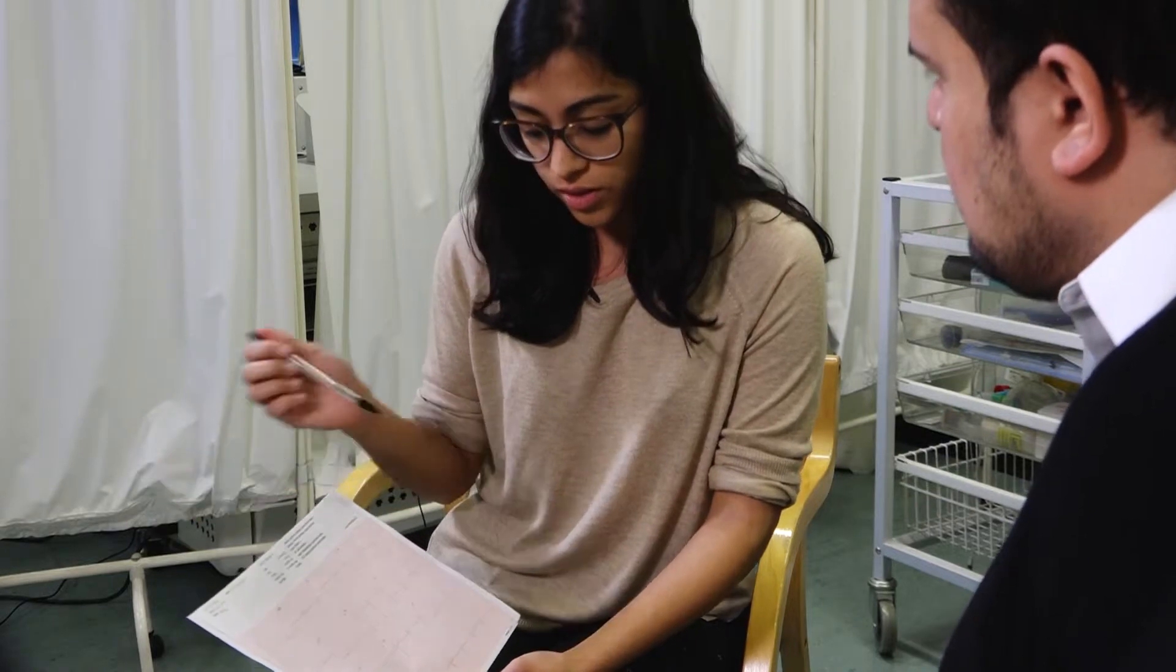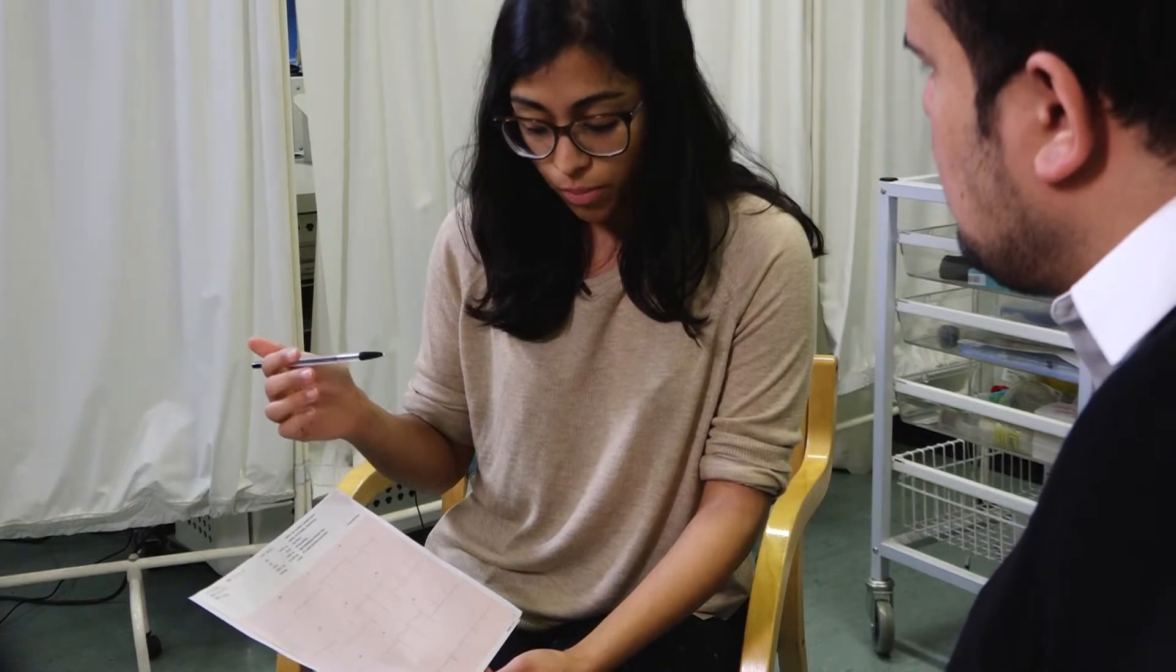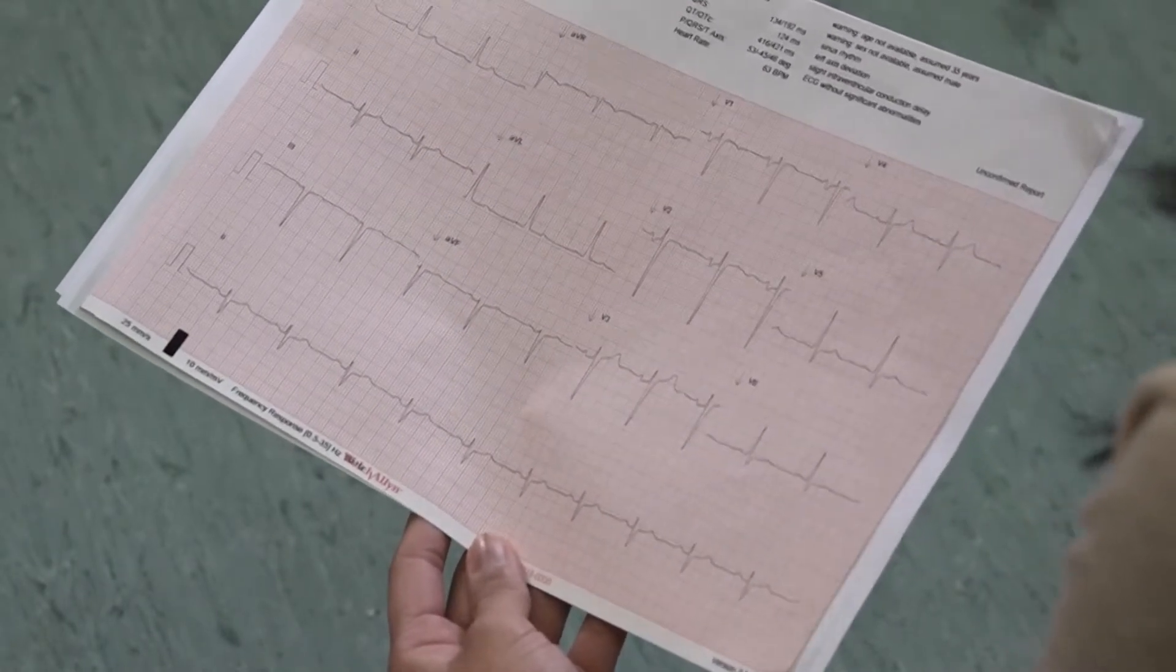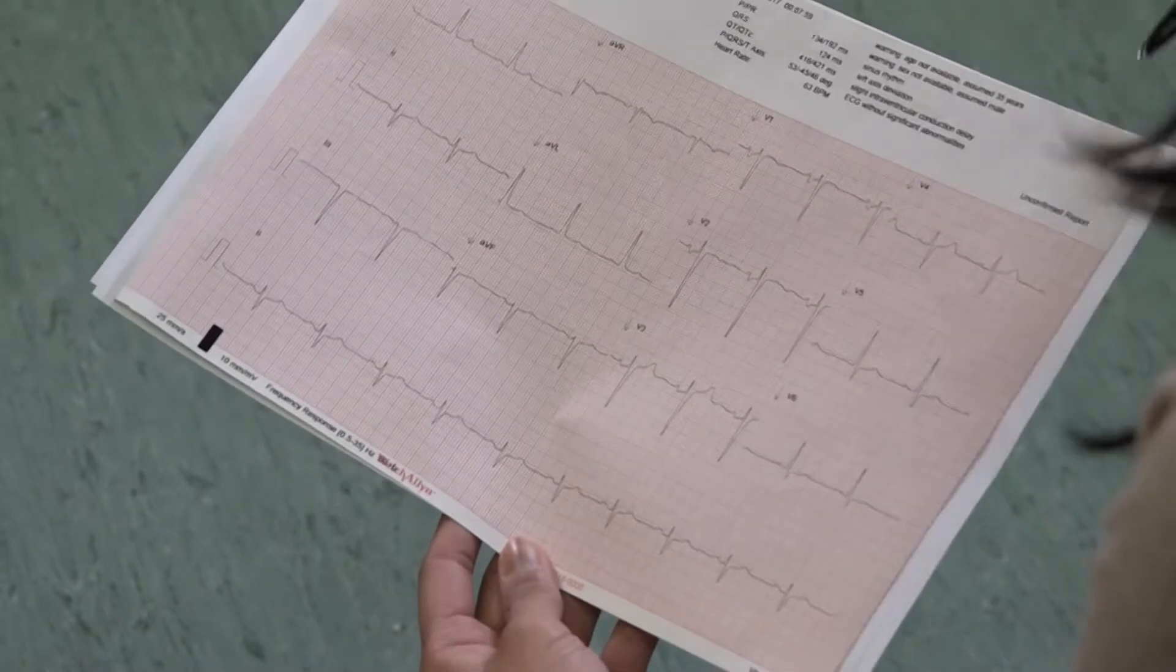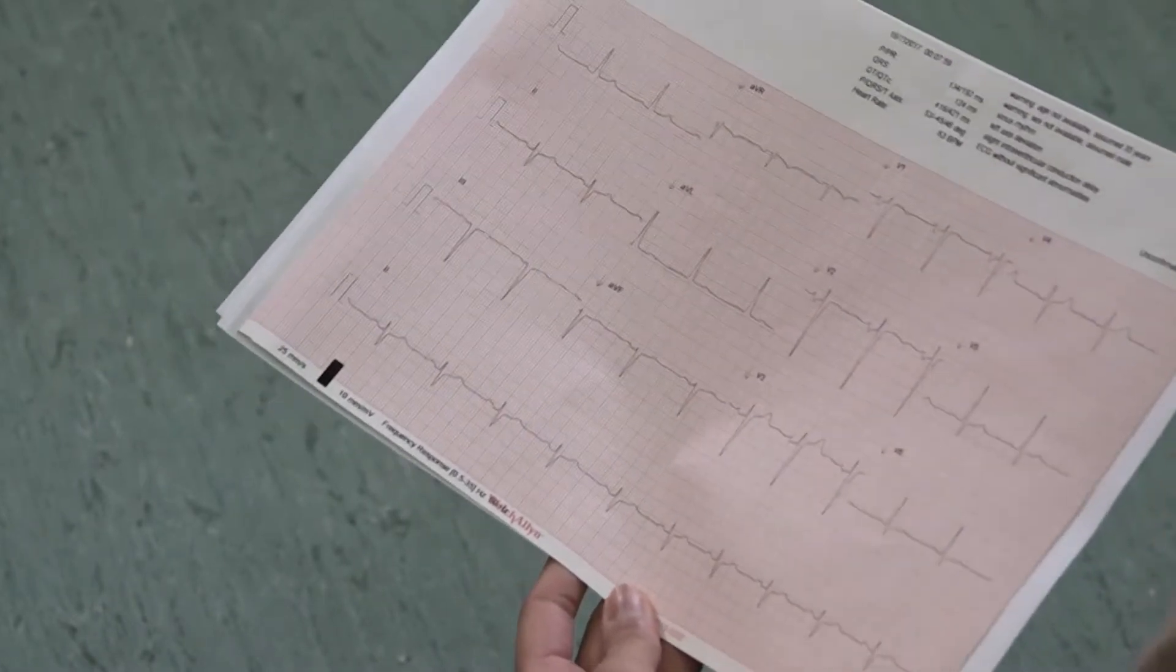The next component we'd normally look at is the QRS complex. The most important aspect of the QRS complex is whether it's narrow or broad. Narrow is anything less than three small squares and broad is anything more than three small squares. You have different abnormalities associated with broad complex QRSs.